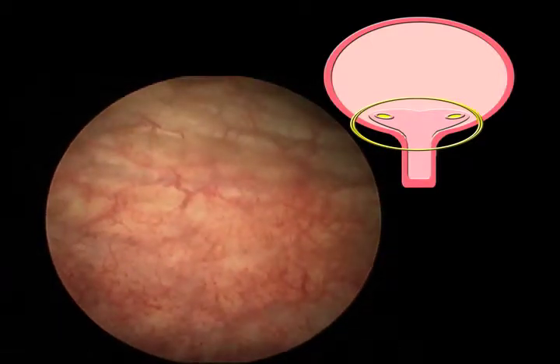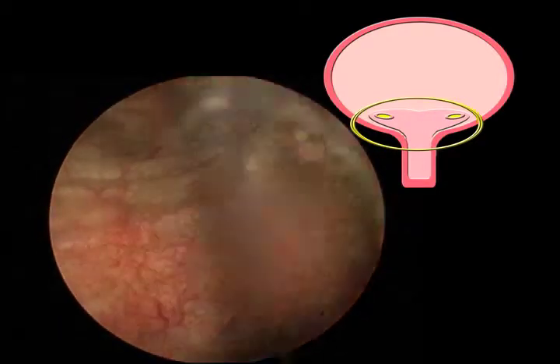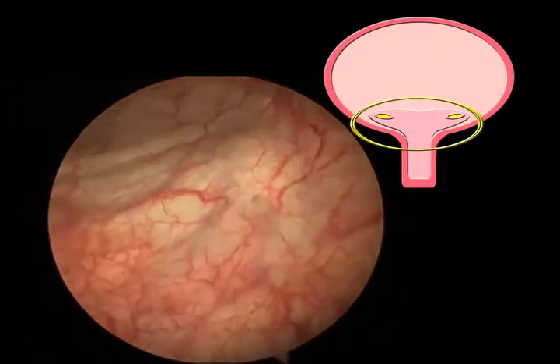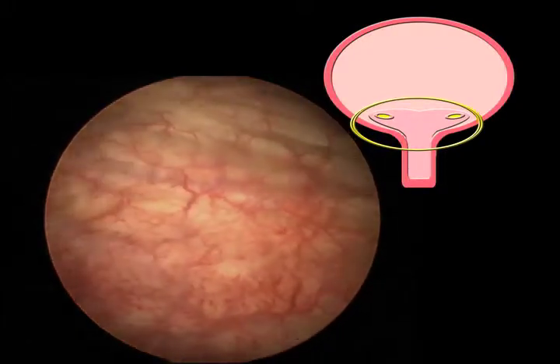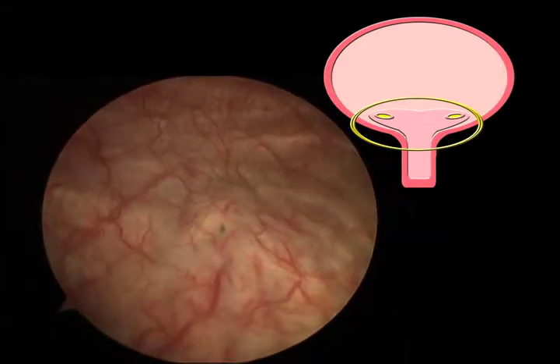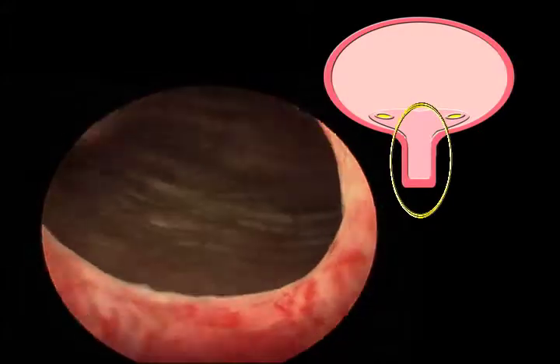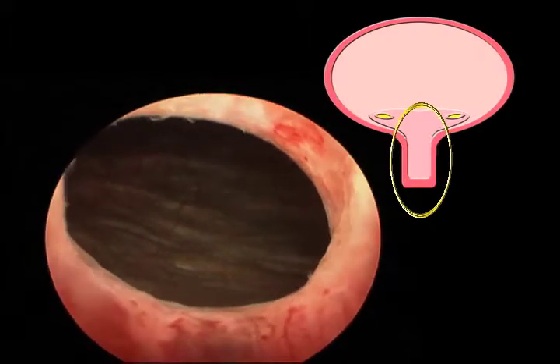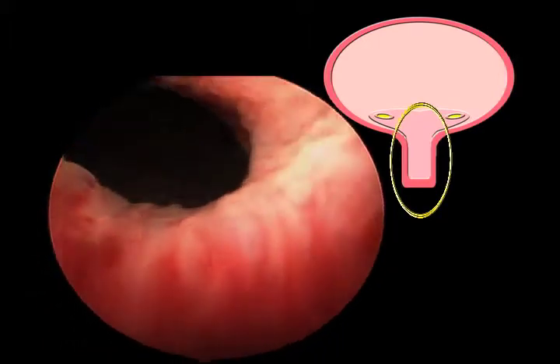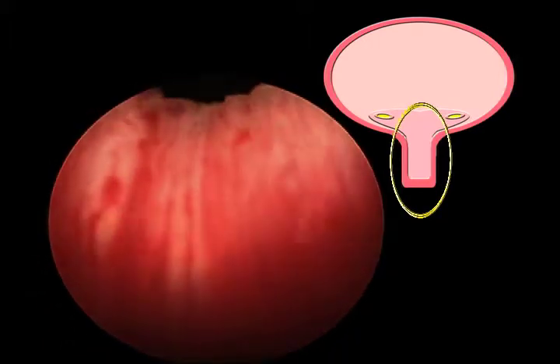The trigone can now be examined. The ureteric ridge can be identified, as well as the ureters. Examination of ureteral patency can be performed if indicated. The procedure is completed with an examination of the proximal, middle, and distal thirds of the urethra to rule out evidence of pathology within the structure.